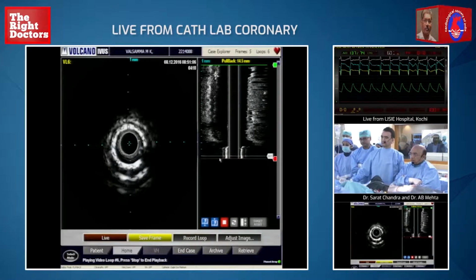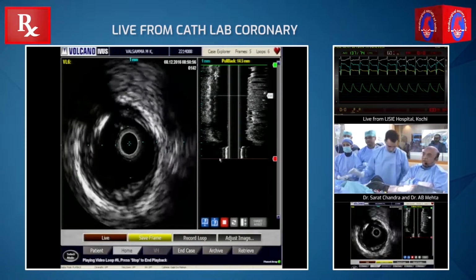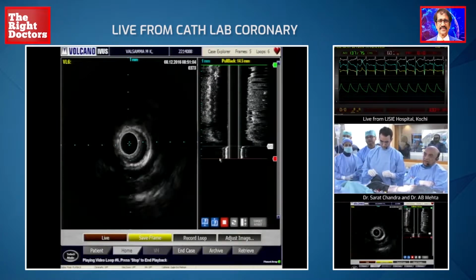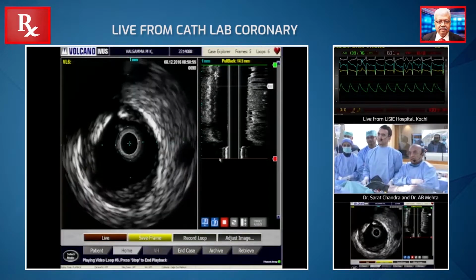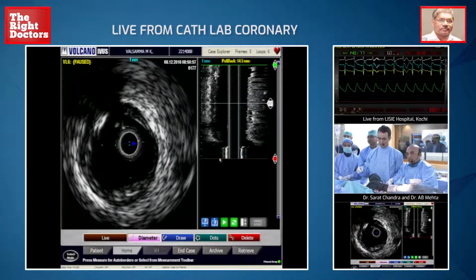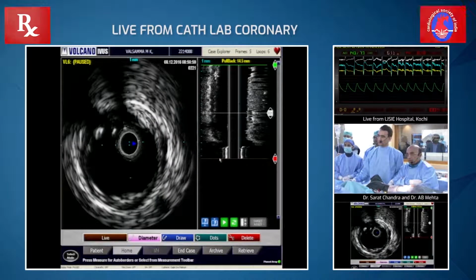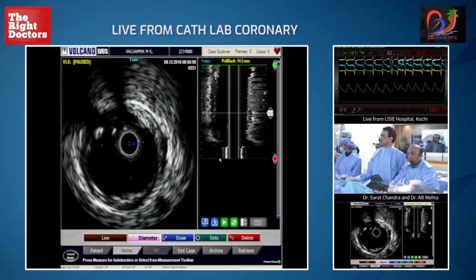So our strategy would be, by the time you come back, you're going to the next lab. We will be stenting the LAD and then try to cross through the strut of the LAD. And before that, I think we'll balloon dilate both. Do a kissing balloon, then put a stent here. You might not want to, but this is such a tight lesion that by the time I put the stent in the LAD, there is a strong possibility that the lesion in the diagonal may completely close. So we have ventured to dilate that very gently, and we'll see what to do.